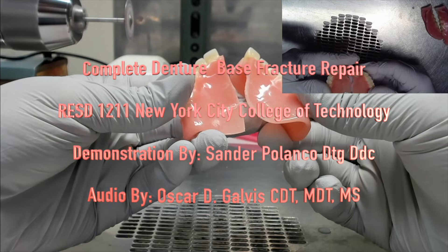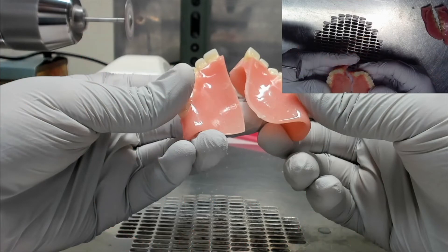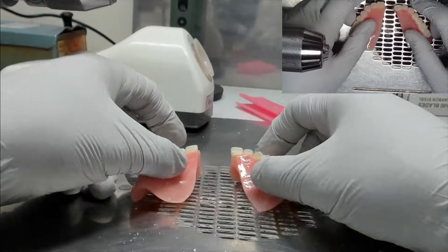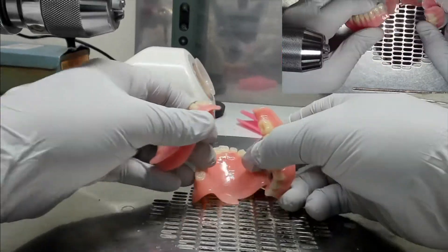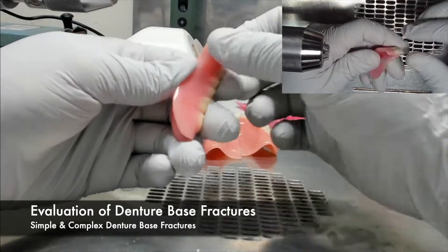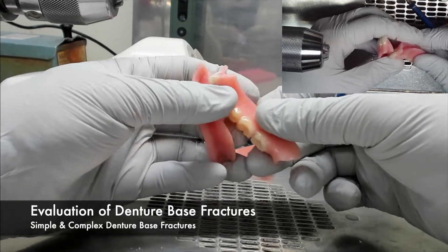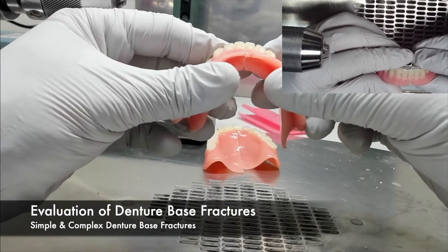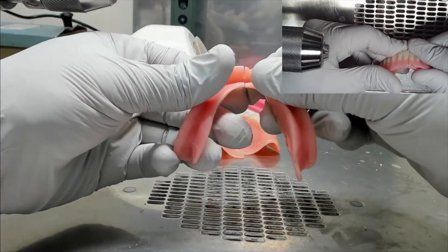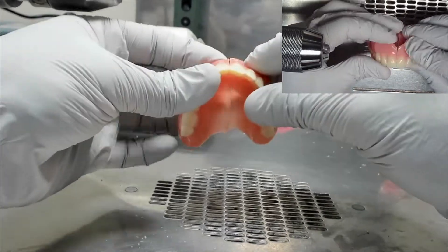Before we get into the actual evaluation of a fracture repair, please note that you should be wearing the proper personal protective equipment when working with acrylics. Once the personal protective equipment is on, it's time to evaluate the denture base fracture itself. We need to categorize these fractures, whether they're simple or complex. Simple categorized base fractures are parts that can easily be fit back together, while a complex denture base fracture usually has pieces that are bent or has portions of the denture missing.